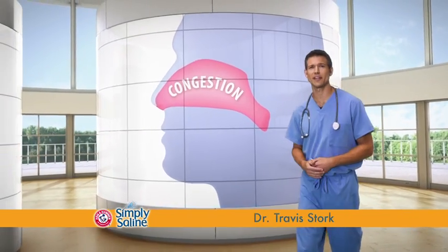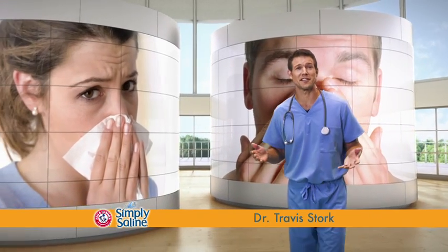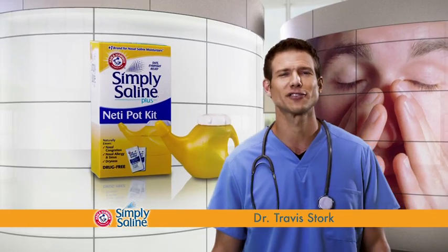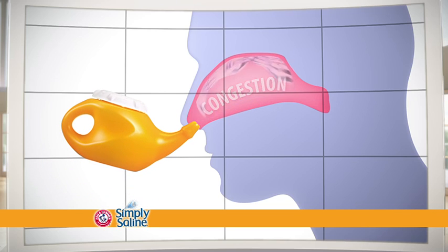Congestion. You can take medicine to treat it and the sniffling and sneezing that come with it. But why not just get the congestion that's in there out? I'm Dr. Travis Stork for Arm & Hammer Simply Saline. The neti pot is an all-natural, drug-free way to flush congestion out.